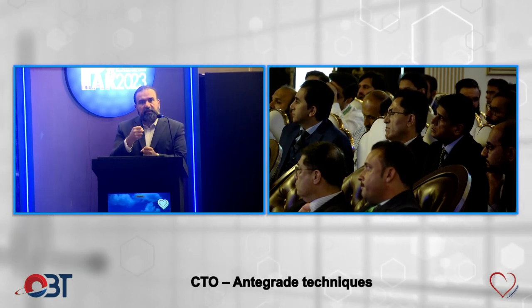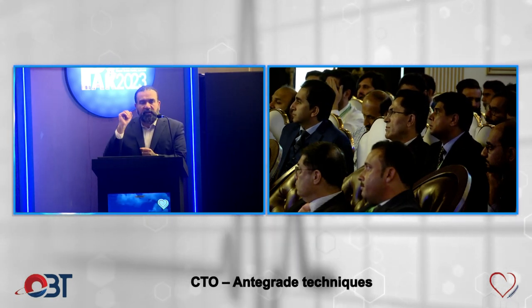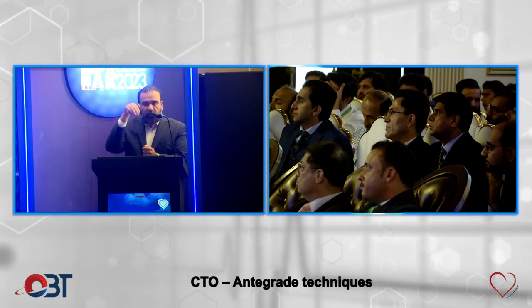And then the third thing is, joke again, I haven't done it, like in ek zamana tha jab log karte the, was contrast induced or contrast mediated star. Wo phir dhrale se contrast inject karte the, hoping ki contrast jo hai, wo kahin se kahin will break back into the true lumen. But that was very destructive.